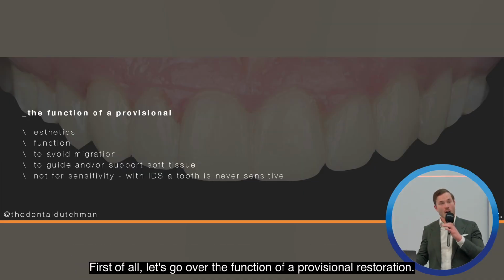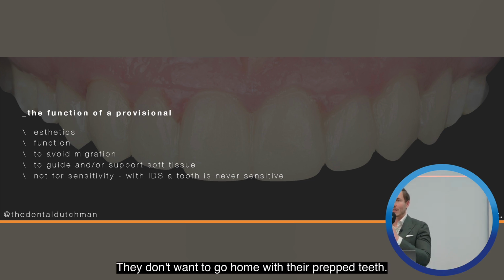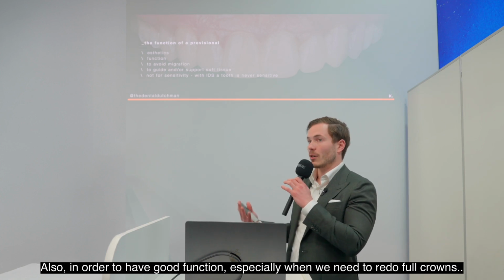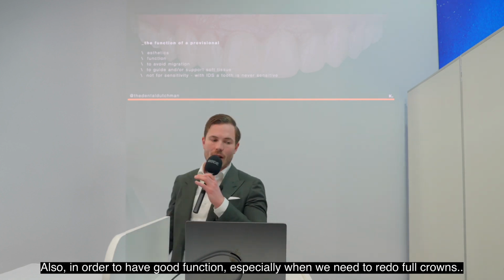First of all, let's go over the function of a provisional restoration. It's mainly for aesthetics because the patient wants to go home looking nice. They don't want to go home with their prep teeth. Also, in order to have good function, especially when we need to redo full crowns.